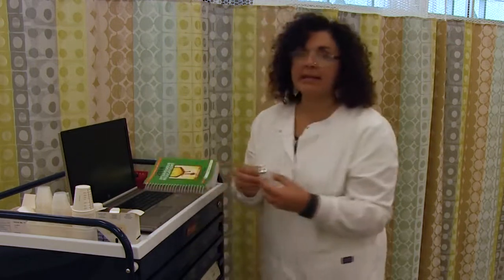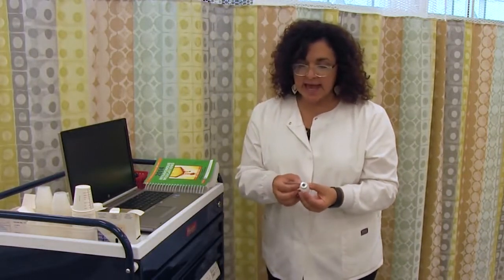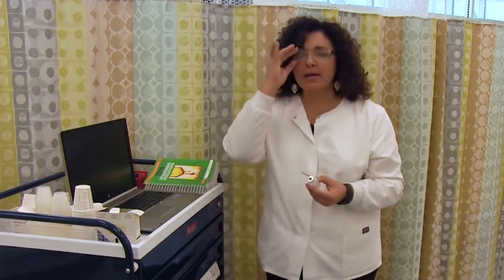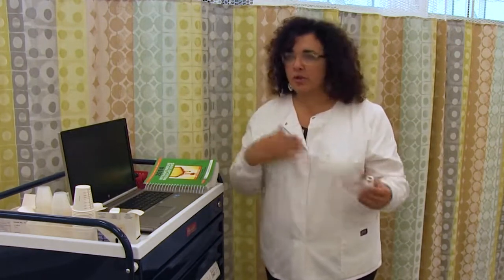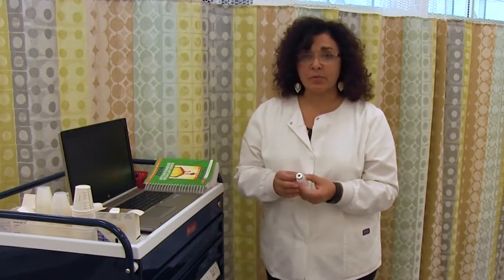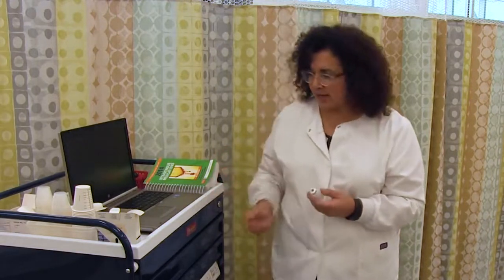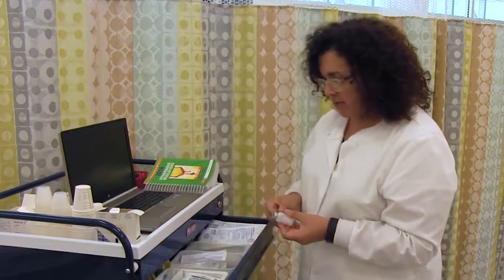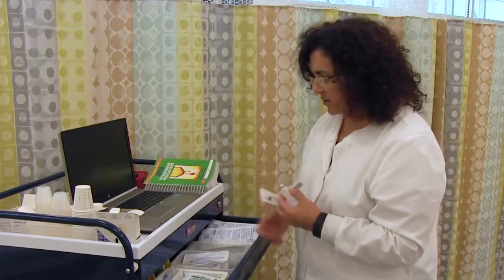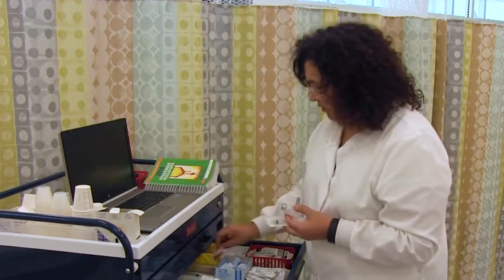I'm also looking at the manufacturer's expiration, and I see that it can also be given by the IV route, all on my labeling. Now I need to think about supplies, because I certainly don't want to be running in and out of the room. So what supplies do I need? In the NRL hospital, remember that we prepare next to the patient. So I need to take in a syringe and 30 milligrams per milliliter. I have a 30 milligram dose, so I'm going to take a 3 milliliter syringe, and then I am going to grab a red fill needle.